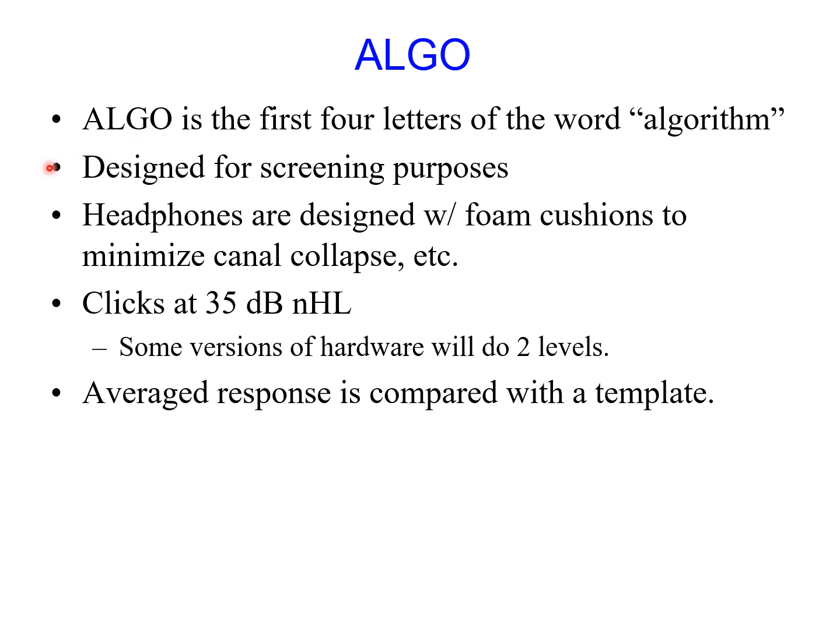ALGO is designed for hearing screening purposes. It's just for screening, not for diagnostics. So that means you are primarily dealing with newborns or young infants. As such, you want to be careful about the headphones you use. You likely will use circumaural headphones for children or young infants, and for newborns and very young infants, you probably will use a specialized ear cup.